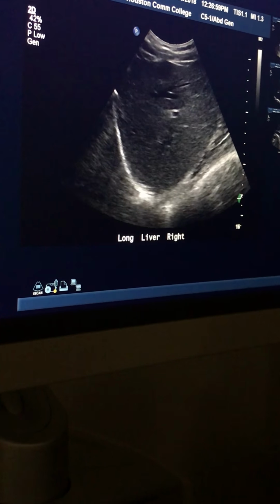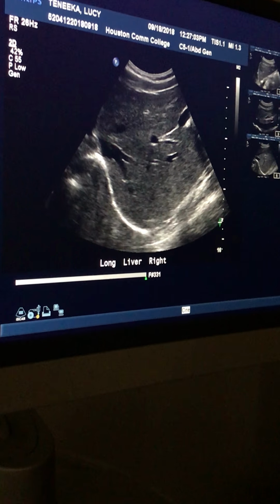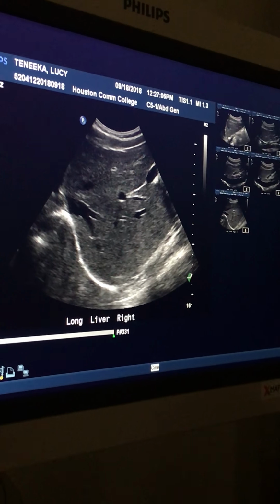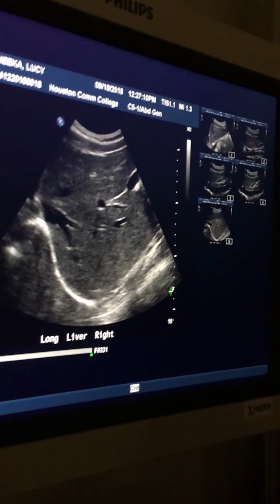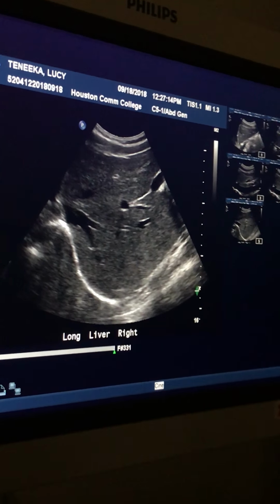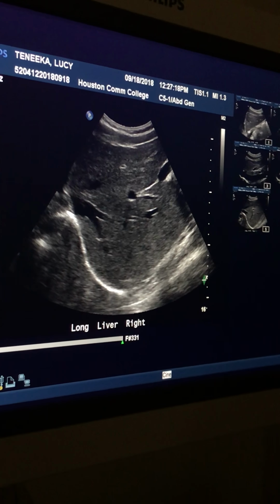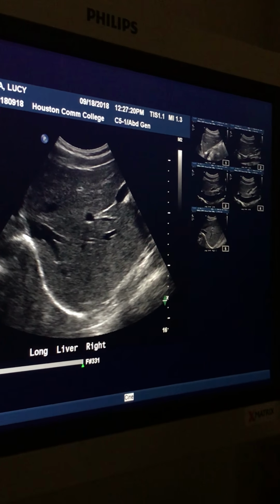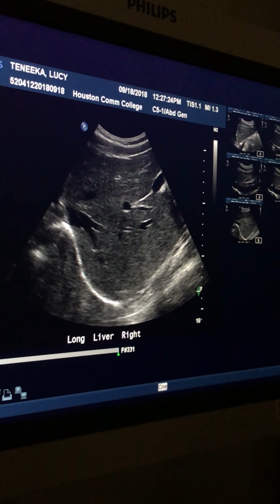And it shouldn't be on the half an inch at the bottom. No. So you want the whole liver. I want the liver as close to the bottom of the screen without cutting it off. What about the main lobar fissure, does that need to be in the picture? It can or it cannot. It doesn't matter if it is or not. It depends on the twist. This one just looked nice. But then your focus is good at the bottom of the liver still? Yep, right at the bottom.